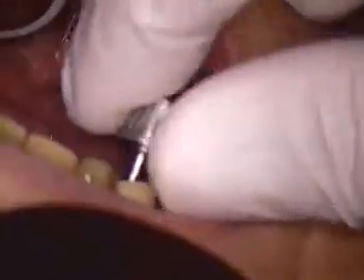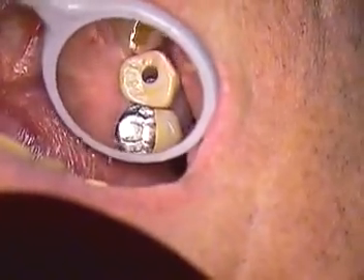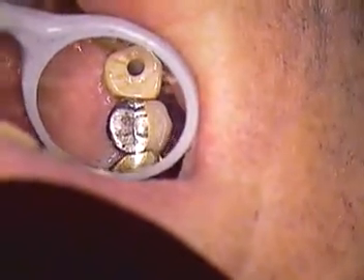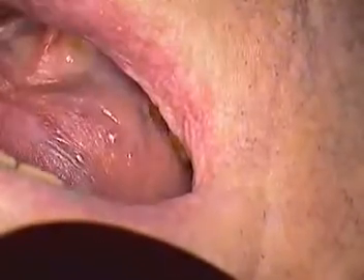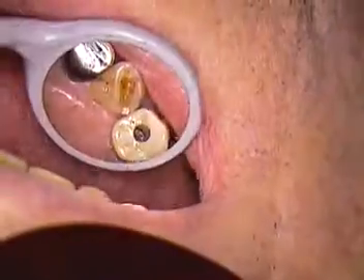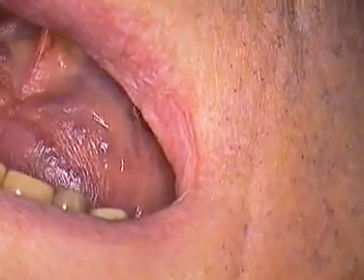We'll just slowly hand tighten that. Richard, if you feel any pressure on any of the adjacent teeth, just let me know. We'll use some thin floss — I believe that's a glide floss, very, very thin. We can just start checking the contacts now. That's the mesial contact and the distal contact. It snaps without shredding — that's good news. We'll hand tighten again.